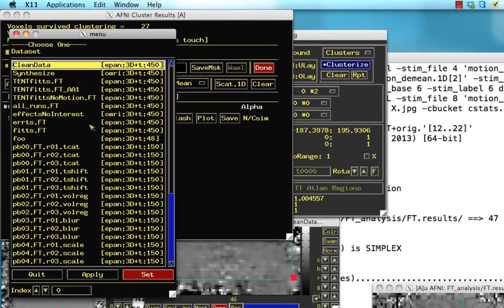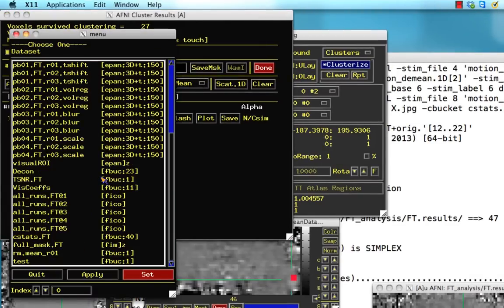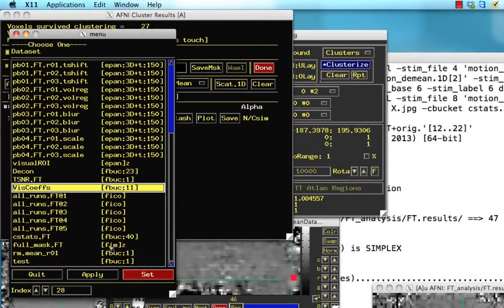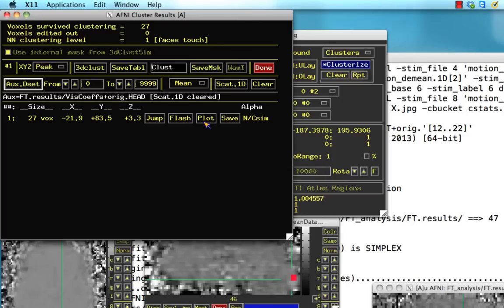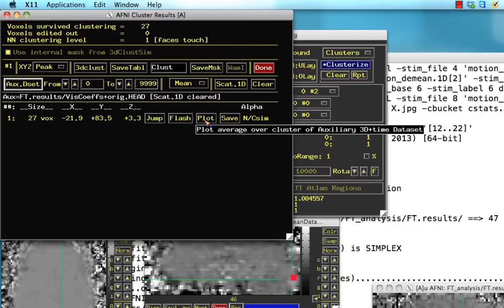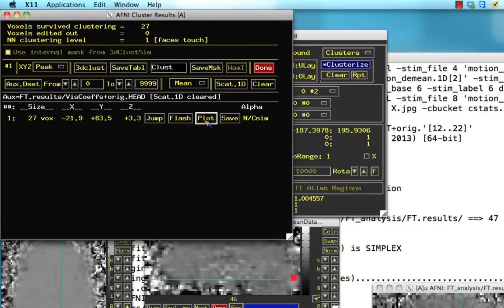Now if I load up my auxiliary dataset—remember I just created this dataset called visual coefficients—I set that, and now when I plot this it's going to extract from this little ROI right here. It could be any blob that you have from a statistics dataset or ROI that you created. It doesn't matter.